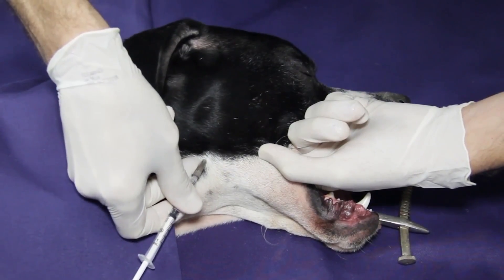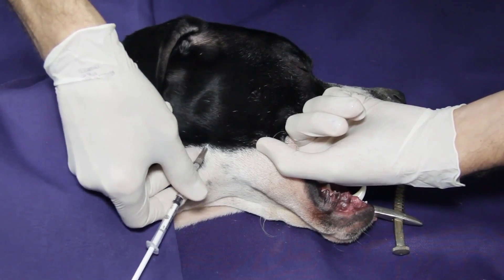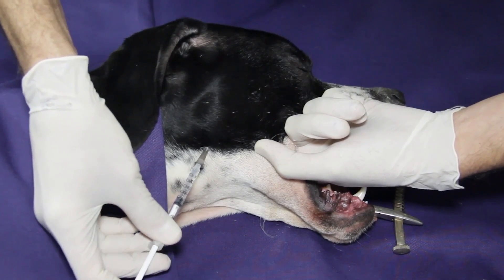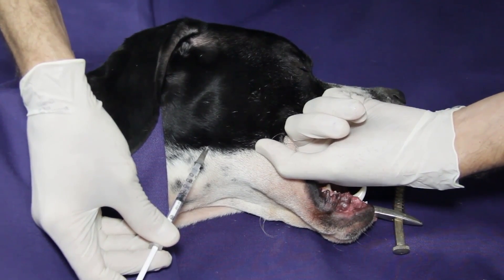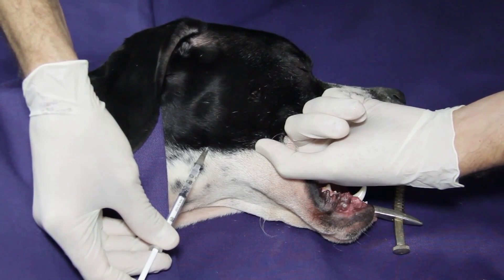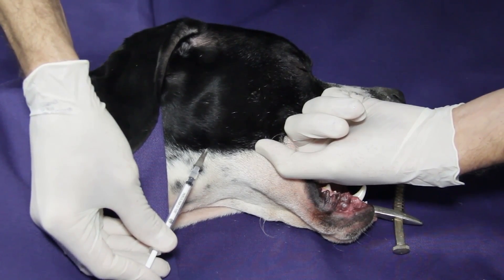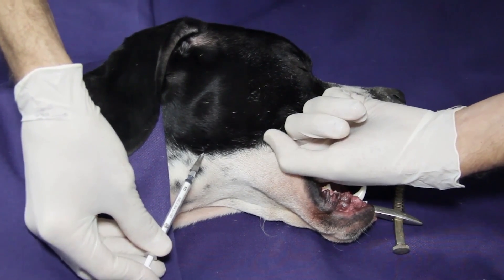The needle is directed towards the lateral canthus of the eye. The depth of insertion is where this line crosses the first imaginary line. Aspiration is performed to confirm proper placement, and local anesthetic is injected slowly, perineurally, as the inferior alveolar nerve enters the mandibular foramen.